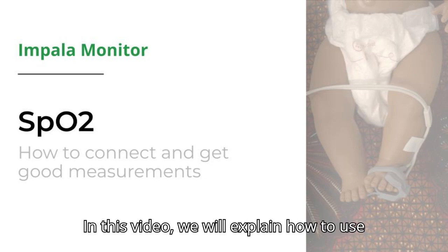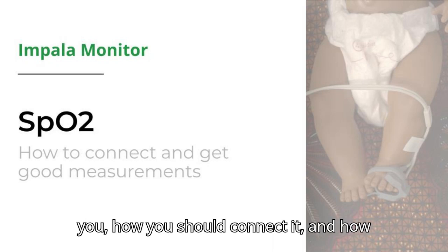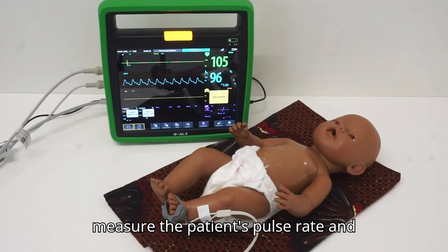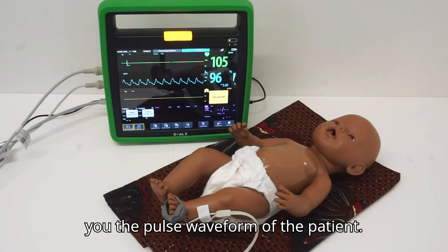In this video, we will explain how to use the SpO2 probe, what it can measure for you, how you should connect it, and how to make sure that you get proper measurements. SpO2 probes can measure the patient's pulse rate and oxygen saturation. It will also show you the pulse waveform of the patient.